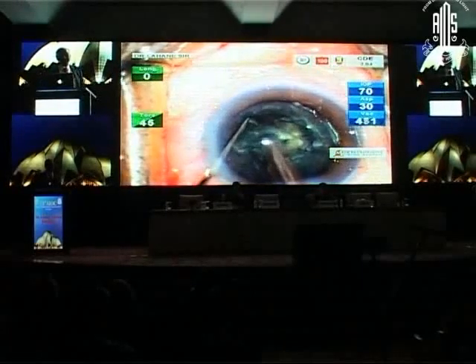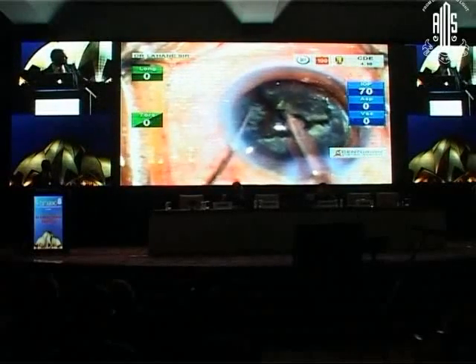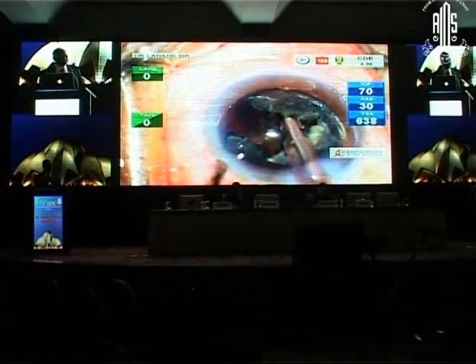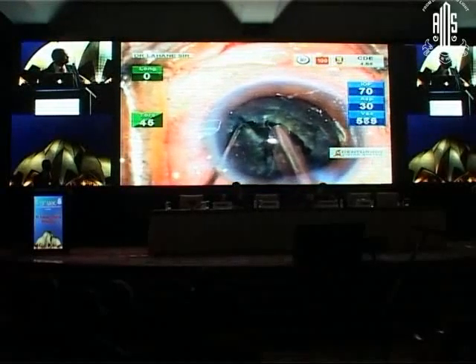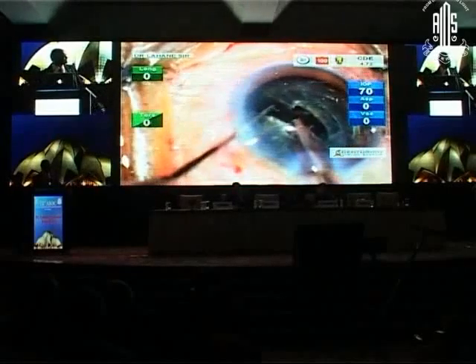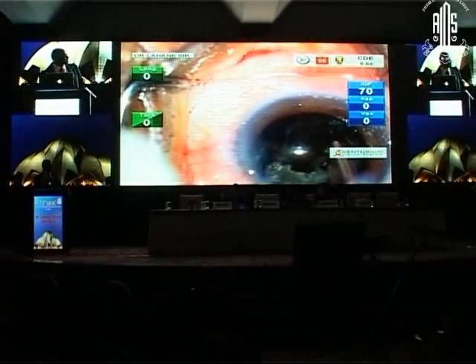And if it is not separated up to the center, now again you see, then the fibers which are there behind, in the posterior portion of the nucleus, these leathery fibers will not be separated and the piece will not come to you. Again you see this, and you can see in the center the fibers were not separating. So I tried to separate those fibers. Again I am going in.